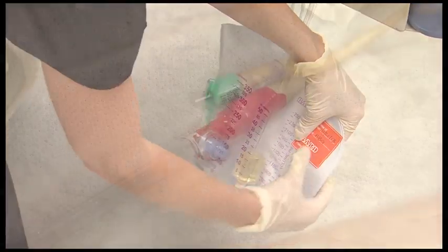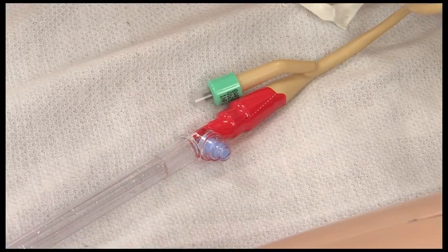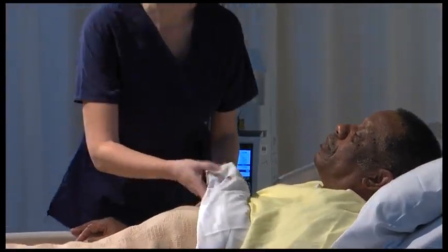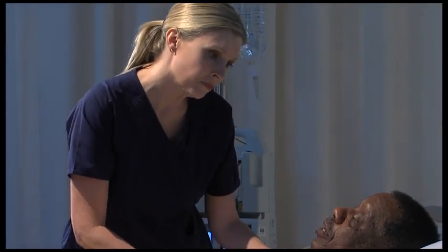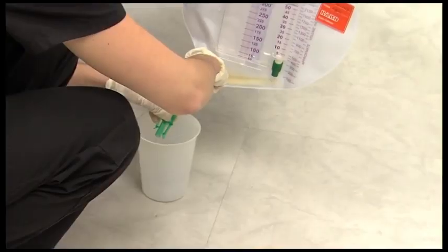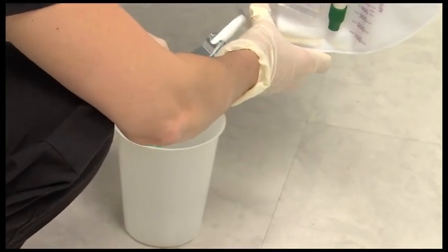It is recommended to maintain a closed drainage system whenever possible by utilizing pre-connected sealed catheter tubing junctions, following physician's orders or per hospital policy. A patient's Foley catheter system should be monitored routinely, which includes evaluating continuing need for an indwelling Foley catheter. The bag should be emptied at regular intervals.